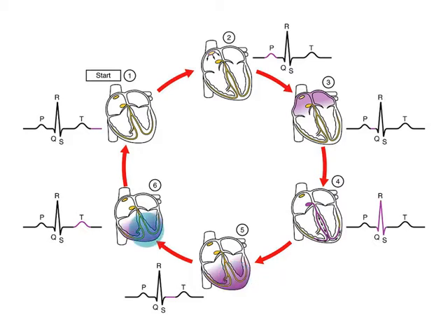And then, a bit of a gray area, the repolarization of the ventricles occurs. We can observe that. We don't observe the atria because it's lost. And we always think of repolarization happening from apex back to base, from the tip back to the top, because we have this upwards deflection. We know repolarization is a negative wave, must be going towards a negative electrode, therefore upwards deflection. There's some argument about that, and we're going to move forward with that interpretation. If you're a cardiologist researching this in the field, there's still active debate today whether repolarization happens in reverse. It seems a little backwards.